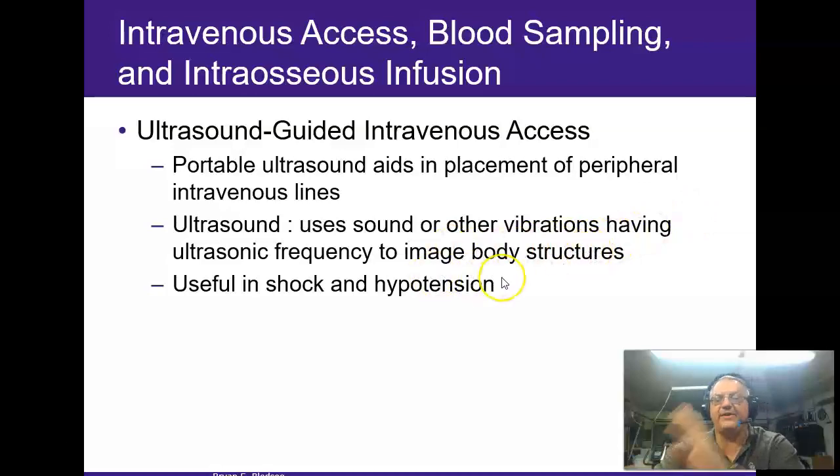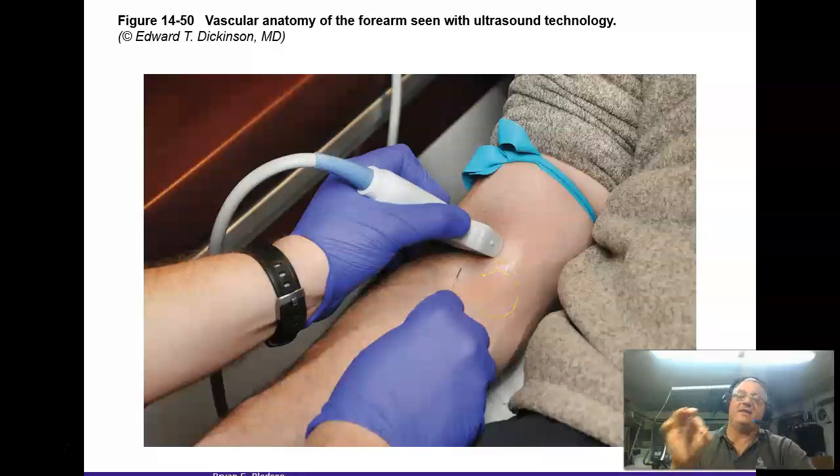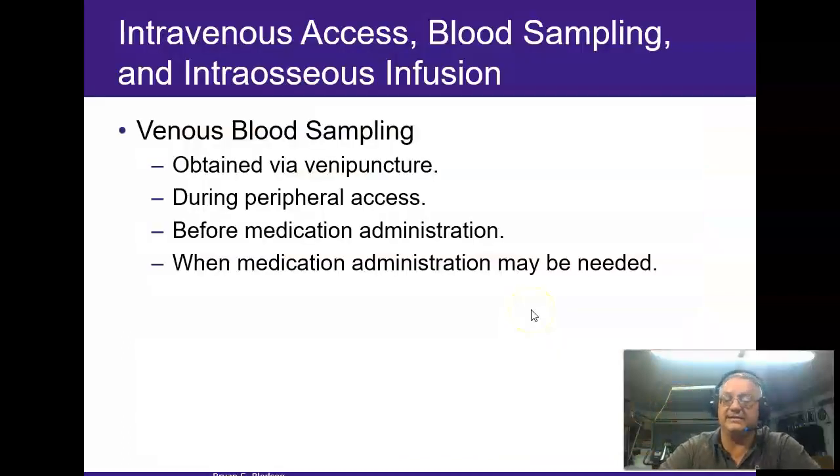ultrasound guided, and I've got a whole other video on this, so I want you guys to watch that one. But basically, this allows you to take a look and see where you're actually sticking the needle and find the actual vessel. The cool thing is you press down on the probe, it actually will flatten the vein so you know which one's the vein. And by the way, the arteries have a pulsating fluid going through it, so you know not to stick that one. Unless, of course, you're trying to start an arterial line, in which case, again, this thing worked wonderful.